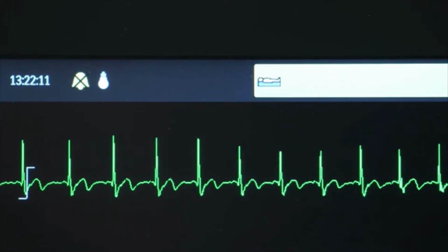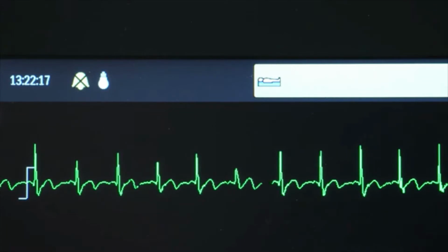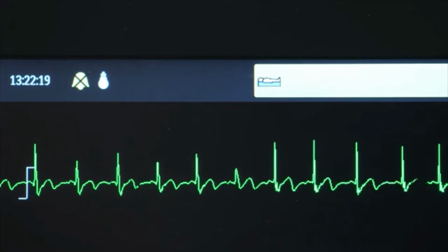In some cases, a 1 millivolt ECG signal cannot be achieved due to patient physiology. In these cases, try to achieve the largest amplitude attainable. If it is not, then you will most likely get artifact.